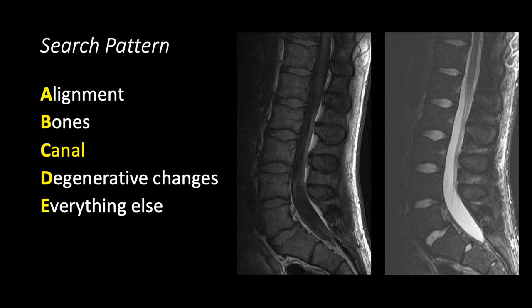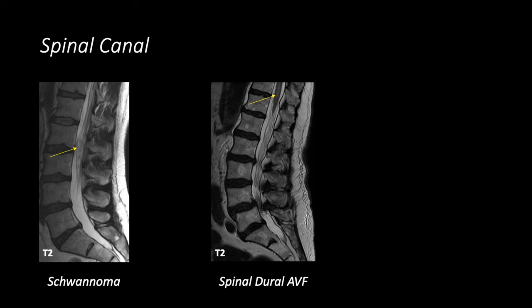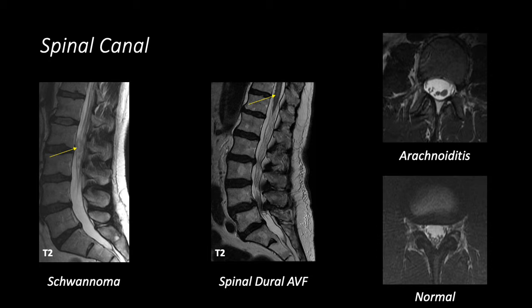The next thing we want to look at is the spinal canal, including the epidural space — which is best assessed on T1-weighted images — as well as the contents of the canal such as the CSF, the distal cord, the conus medullaris, and the cauda equina. Some findings in the spinal canal are obvious, such as a schwannoma presenting as a mass inside the thecal sac. Some are more subtle, such as edema within the conus medullaris in a patient with a spinal dural arteriovenous fistula. We also want to look at the cauda equina to make sure they're normal. An example of arachnoiditis shows aggregation and clumping of nerve roots of the cauda equina.